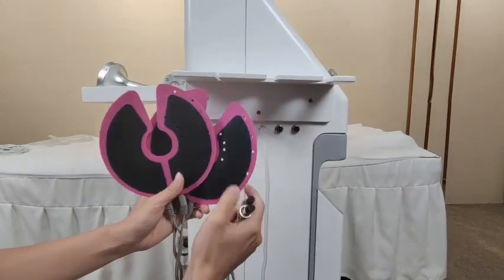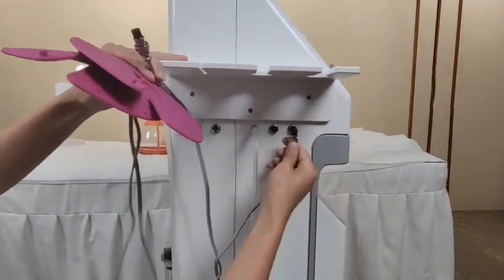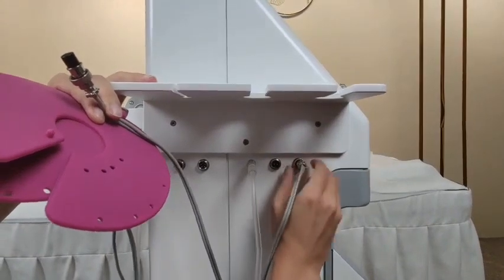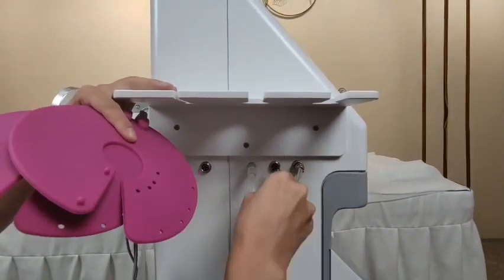This is the microcurrent plates. The same operation — match this hole; there are two needles inside. Match the hole, tie it, and repeat the same operation with the other part.